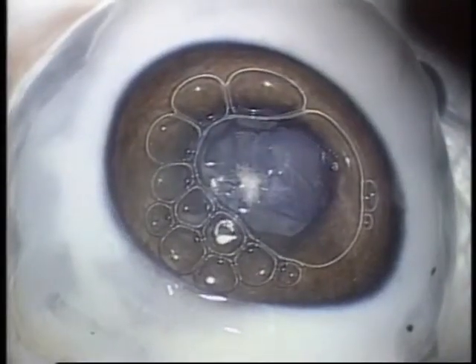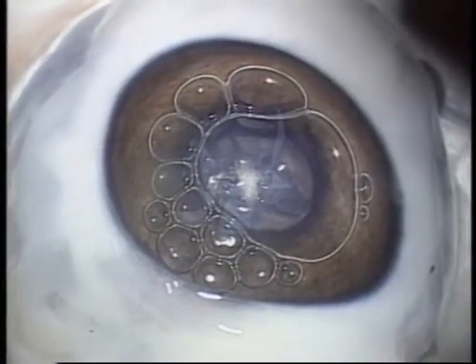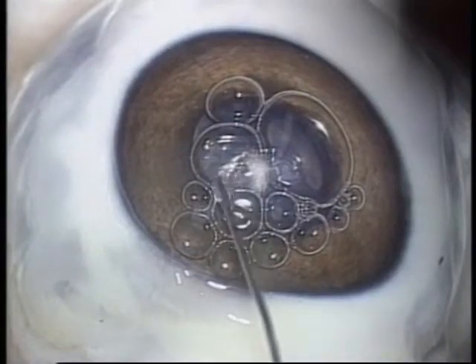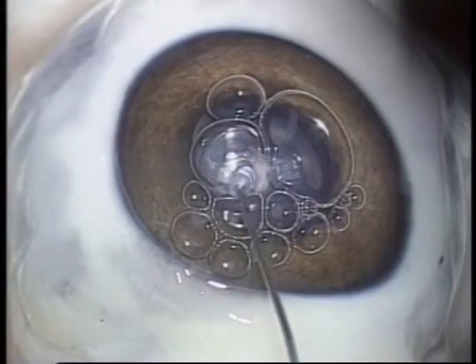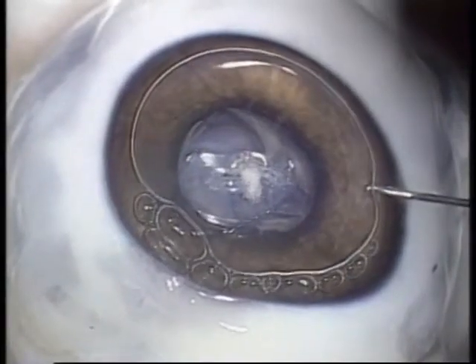After viscote was well washed off, the other incision was coated with viscote. In this case, the same result was also obtained. This experiment showed that viscote had an action of sealing the corneal incision.